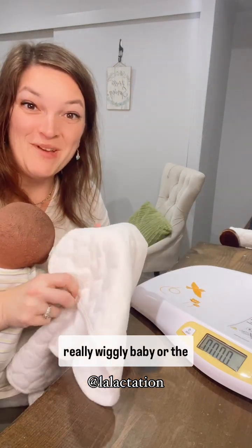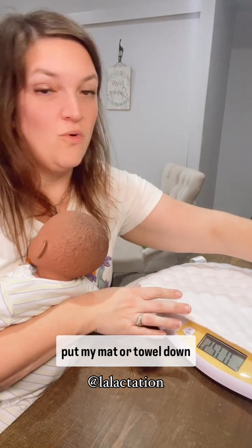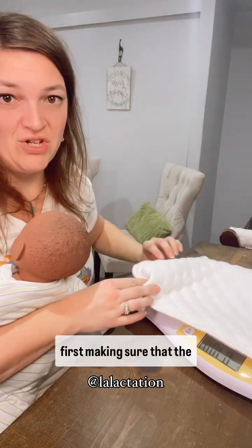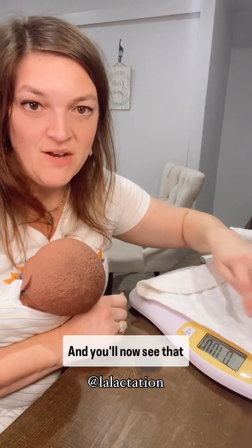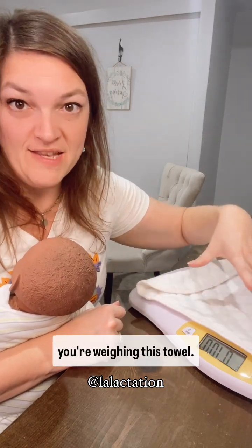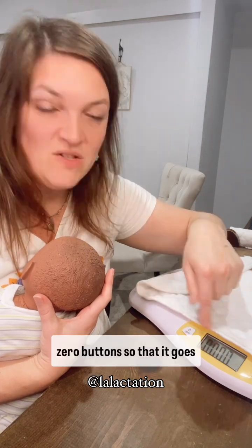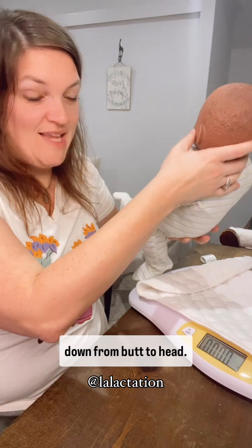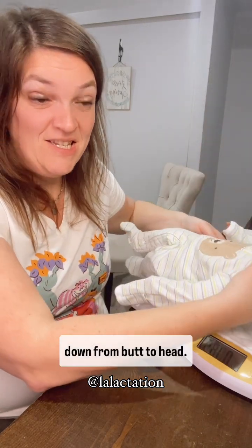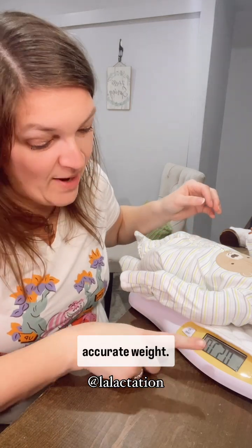Now, if I have a really wiggly baby or the scale is cold, I'm going to put my mat or towel down first, making sure that the edges aren't hanging off. You'll now see that you're weighing this towel. So we want to hit the tare or zero button so that it goes back to all zeros. Then I'm going to lay my baby down from butt to head, gently rolling that baby down so that we can get an accurate weight.